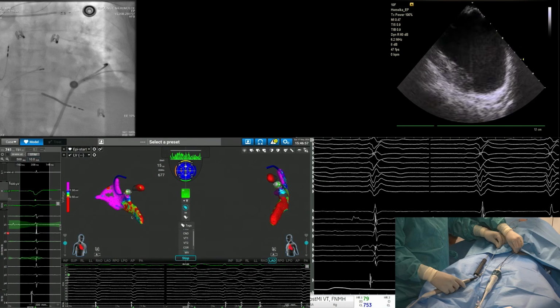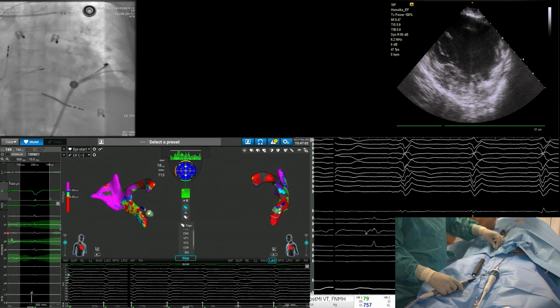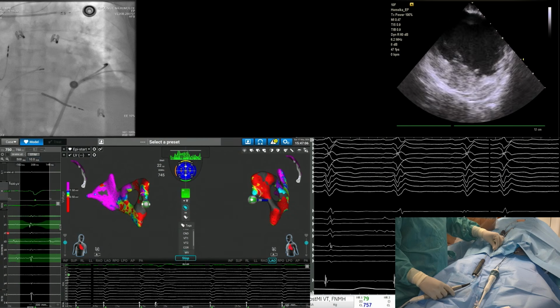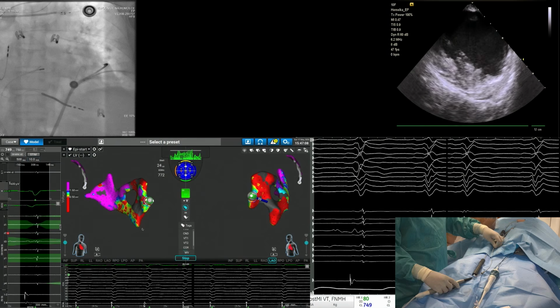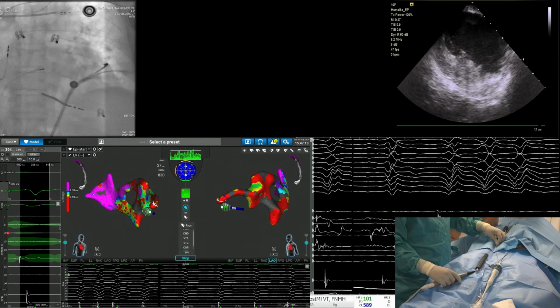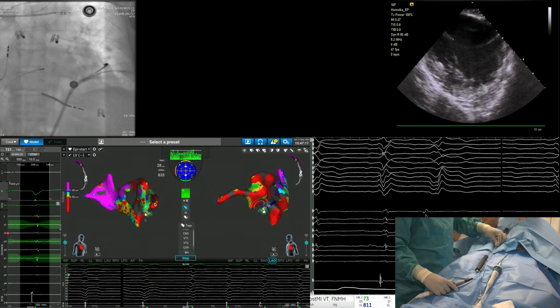So as you can see, there are some very interesting aspects about Affera and the pericardium. One of them is because of its structure, unlike most regular catheters, there'll be some electrodes that will almost by definition be touching the myocardium most of the time, and some electrodes that by definition will not be touching and will be low voltage.